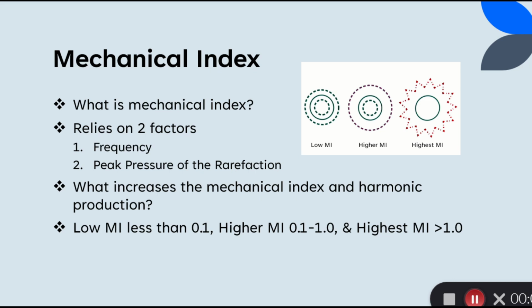The microbubbles expand and contract evenly. Higher mechanical index creates some harmonics because of the nonlinear behavior and is most ideal for ultrasound. The highest mechanical index creates the strongest harmonics but causes the bubbles to expand greatly, which leads to them bursting, which is extreme nonlinear behavior.